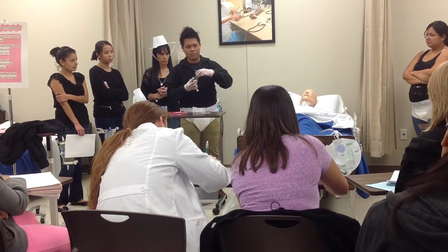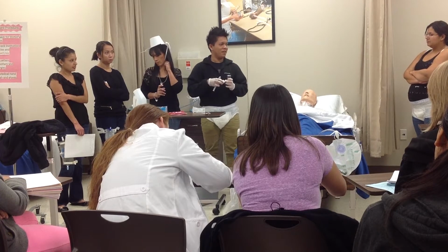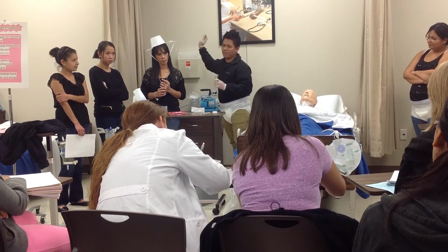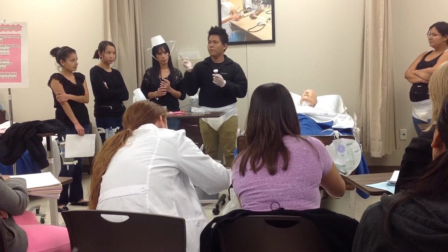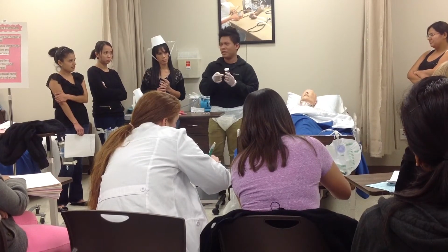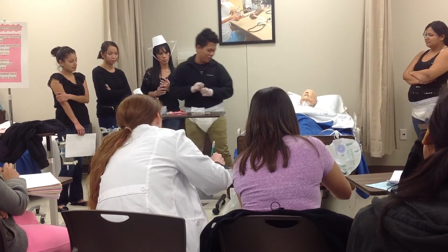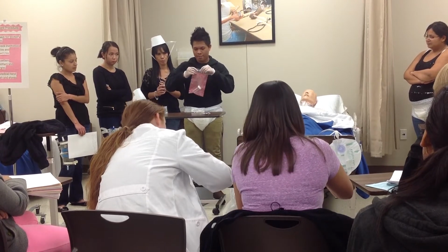And make sure you have your container. Just open it and put the lid on. Then you go ahead and put that specimen all the way in your container and make sure your syringe goes in your sharps container. And put the lid back on. Put your label, date and time, initial on your container. Make sure it's on the container. Y'all know why? Because if you lose the lid, you're not gonna be able to identify the specimen. So what you do is put it in the bag.